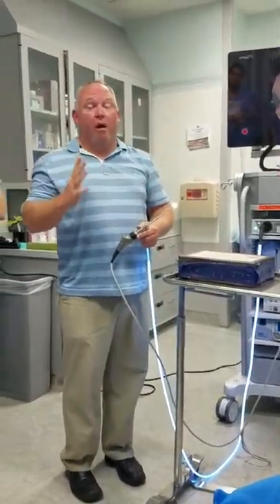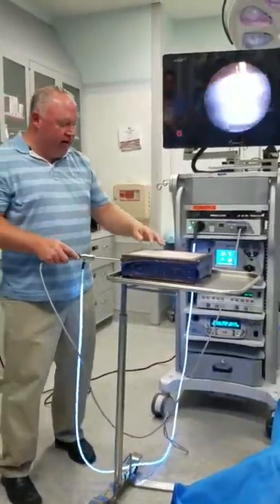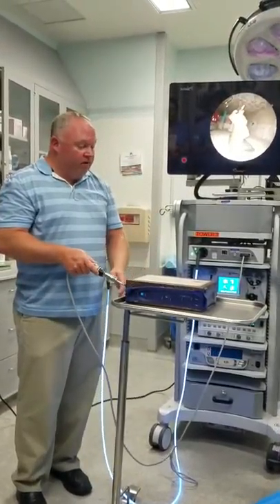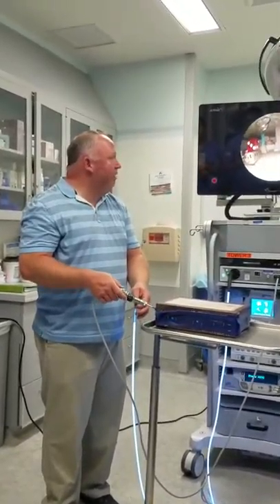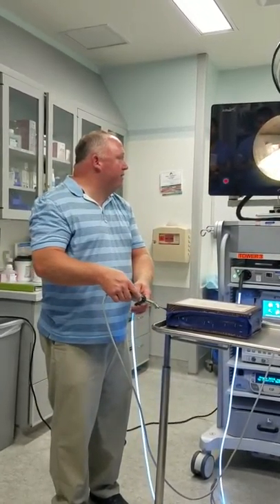What I tell you about scoping is it's a very slow motion, it's not very fast. If you go really fast, it's going to be really crazy. If you get there and you start doing this, it's going to be really weird. You're going to get kind of dizzy, okay? It's going to be a very slow motion. You've got to find where you're at. Figure out what's up, what's down. So what am I looking for? Okay, I want you to go over to the front of the taxi. I want you to find the back of the taxi.